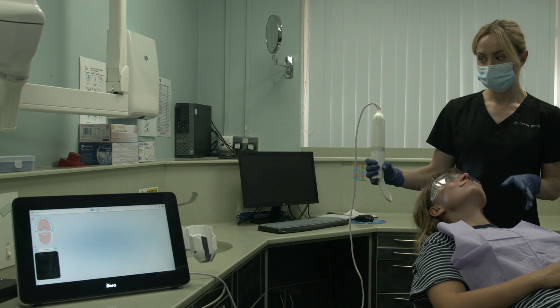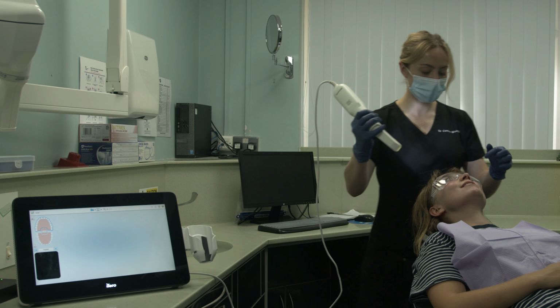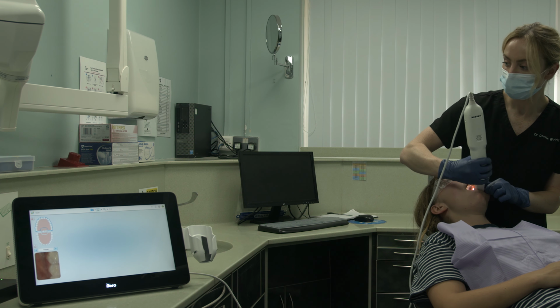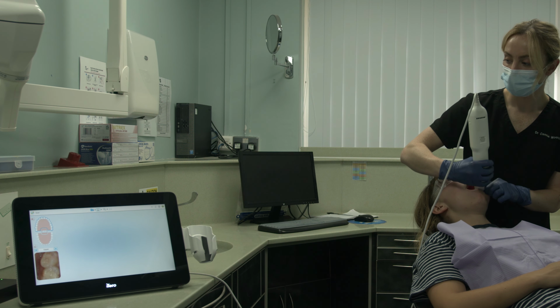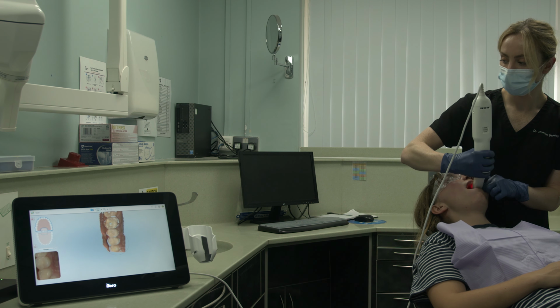So now we've got the lower teeth scanned, I've just clicked at the top here and we'll move on to the top teeth. So again, we start at the back, and all the way around on the occlusal surface.